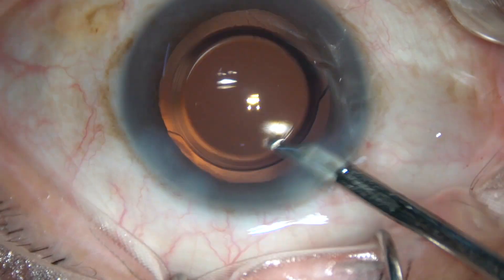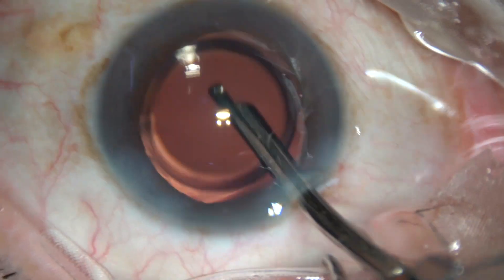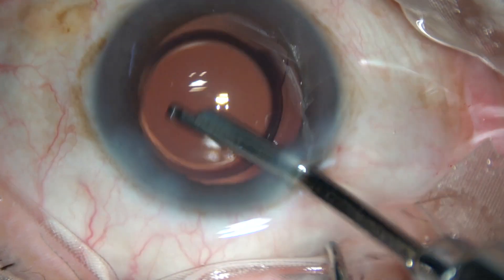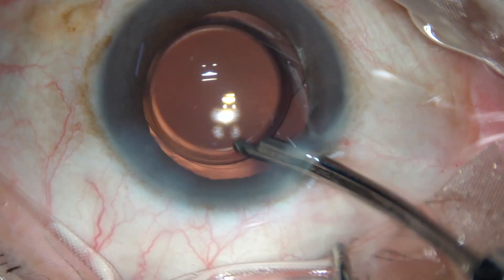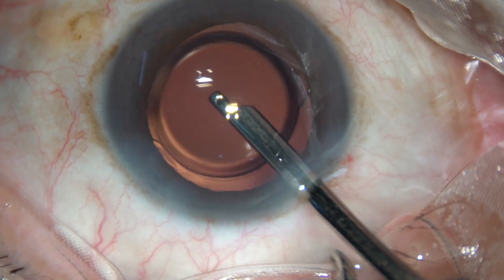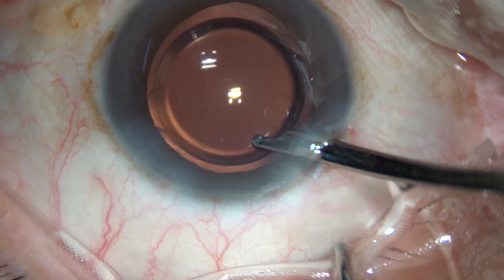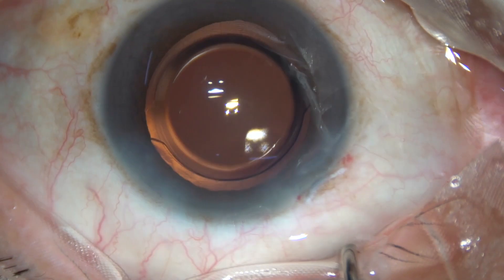At this time we must ensure there should not be any cotton fibre and there should not be any particulate matter in the anterior chamber. So this is the final lavage of the anterior chamber and the capsular bag. Now the anterior chamber is formed and the case is concluded.